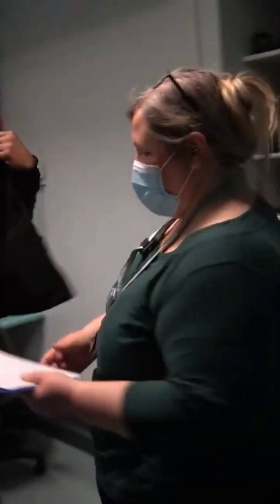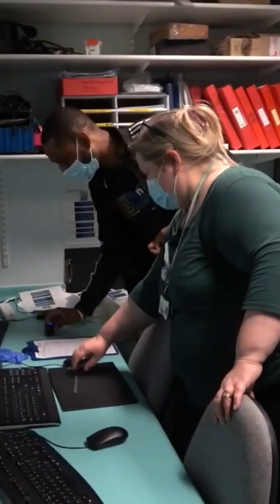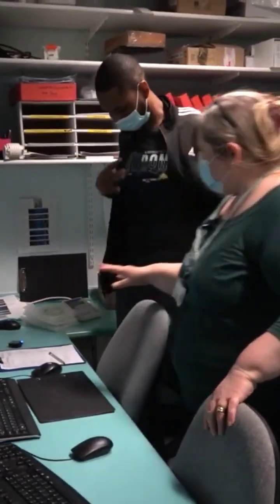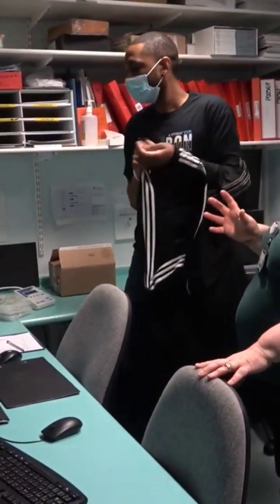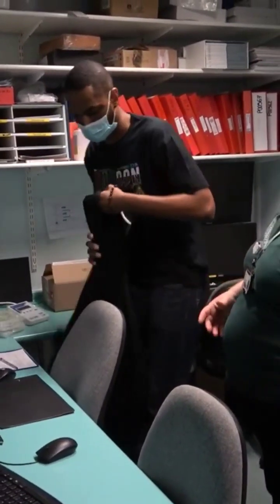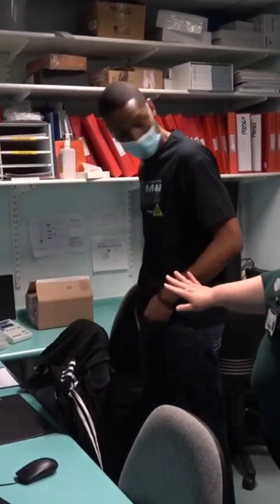Obviously the only thing is you'll have to take your mic off. This is our screening form just here — it is quite detailed, but bearing in mind that this screening form is also for our critical care patients who may be a John Doe that we don't know who they are, so we have to go through everything.